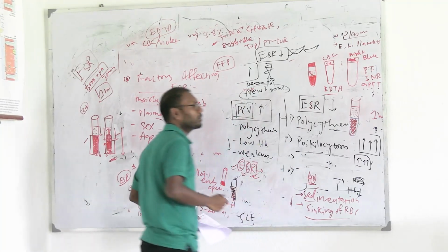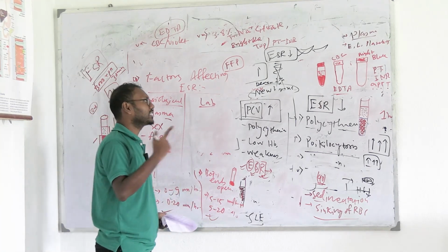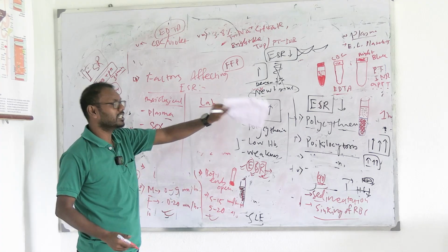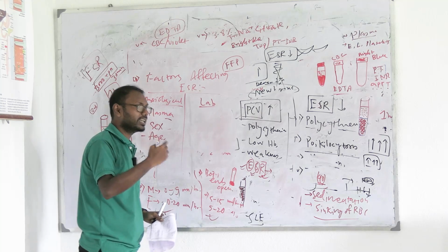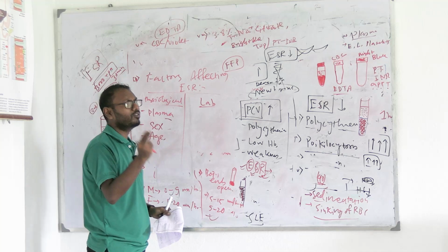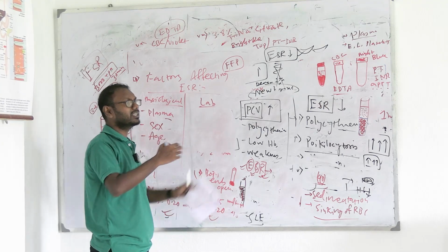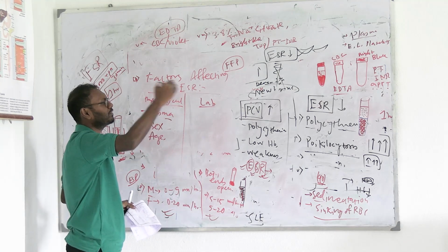Of course it is important. Why would I suddenly think, one fine morning the doctor decides you should do ESR? No, ESR is actually a non-specific marker of any inflammation or infection. Okay, this is not a specific marker. I cannot say if the infection is bacterial or viral or because of other cause. Okay, but I can definitely say here your ESR is raised, that means you definitely have some kind of inflammation or infection. Okay, that is why I say non-specific. As I said today in the theory class, what does non-specific mean? These are not specific results, you are getting a generalized result. That is why ESR is a non-specific marker of inflammation.